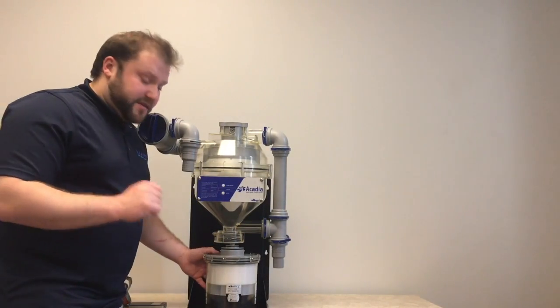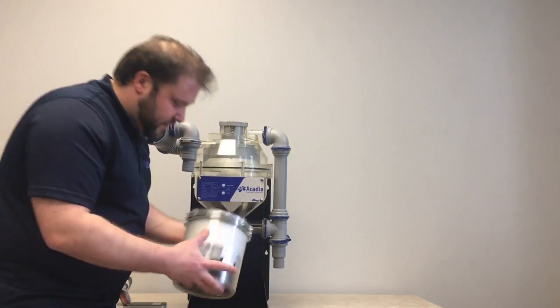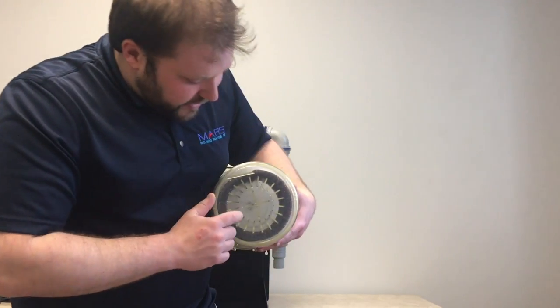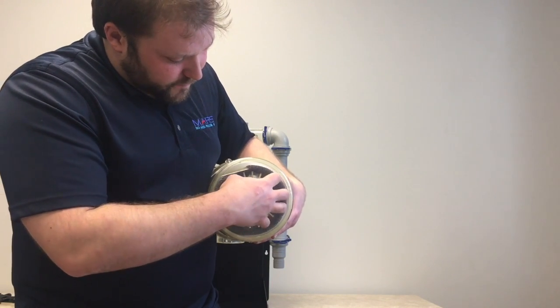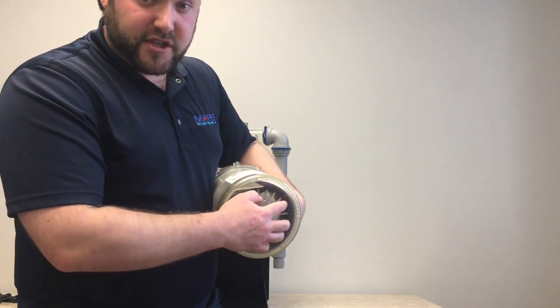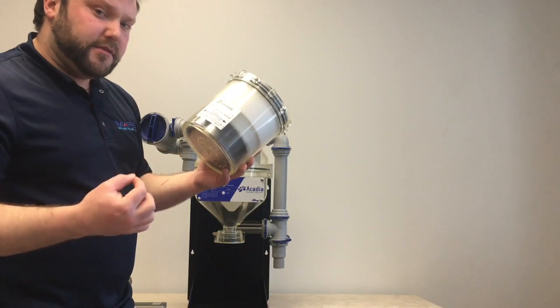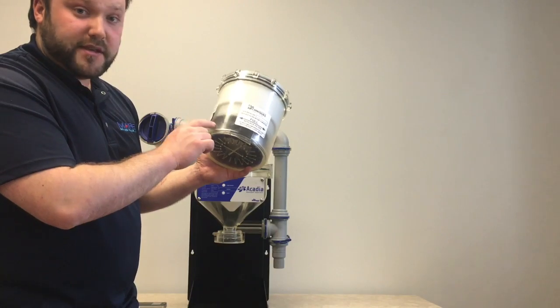When looking to see how full the system is, you'll have to keep in mind the design of the system. So this is the inlet to the filter. It's about a 1/2 inch inlet. And this is where it all settles, in this portion of the filter. Once all the sludge settles here, the water pushes and expands beyond this foam barrier, and the sludge stays in the middle and the water pushes out. The issue with this design, it makes it a little difficult to determine the full line and where the sludge level is. You have to shine through this black foam.